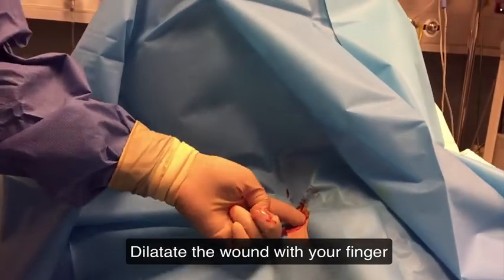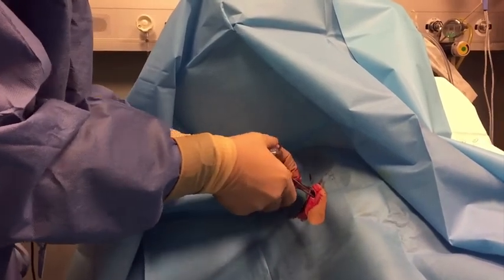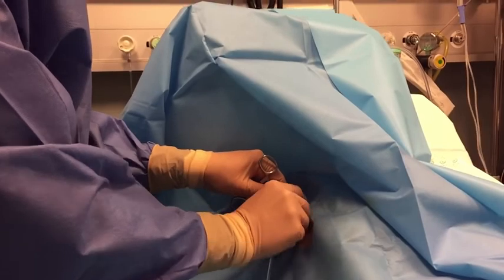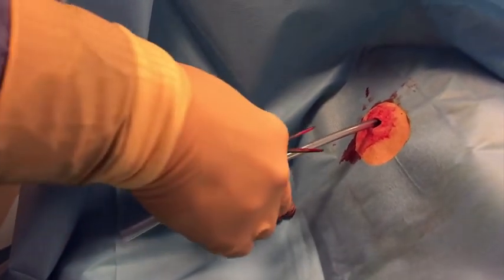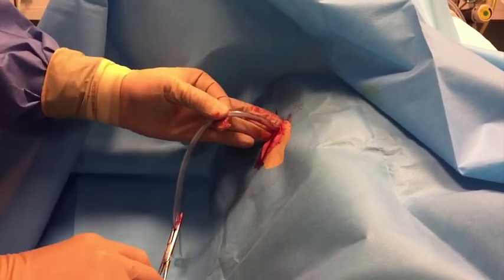Now widen the intercostal wound using your index finger. Introduce the tube in the thoracic cave. You can see and hear air escaping through the tube. The tube is oriented in posterior and upward direction.